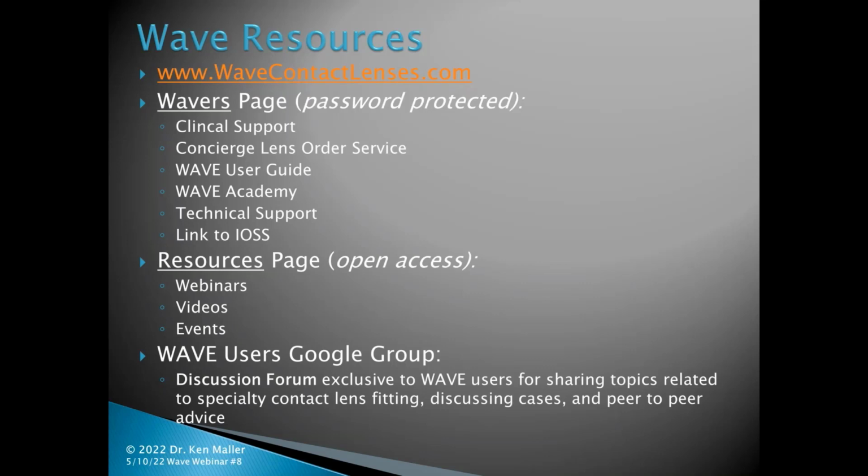And so typically I will try to stay either around the size that they came in at their presentation, or if I have a reason to go bigger, the absolute largest I will go is the midpoint between what I would have done had they been a virginal wearer and the size of their lens. So for example, on my 11.7 cornea, I would typically, on a virginal eye, maybe fit an 11.2. They came in wearing a 9.2. I would not go larger than 10.2 for the very first lens. But like I said, I will typically stay somewhere around where their size is. You know, a fairly straightforward procedure with a lot of good reasoning behind it.